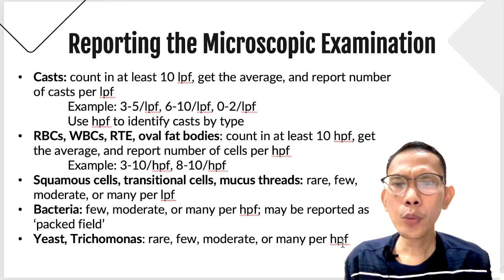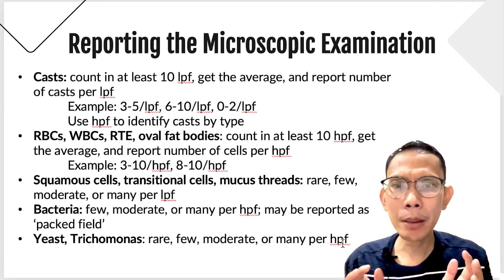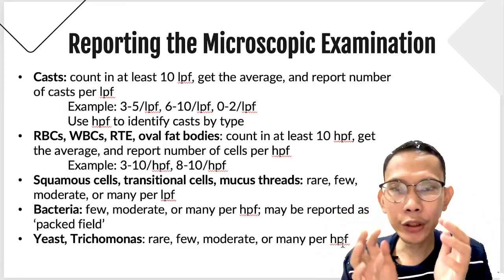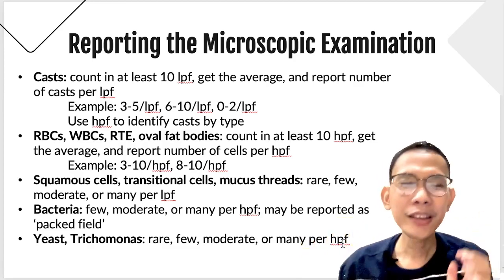Doc Von, when we do the reporting, Doc? I will read WBC first for 10 fields, one by one. Then the next 10 fields, RBC. Next field, WBC. No?